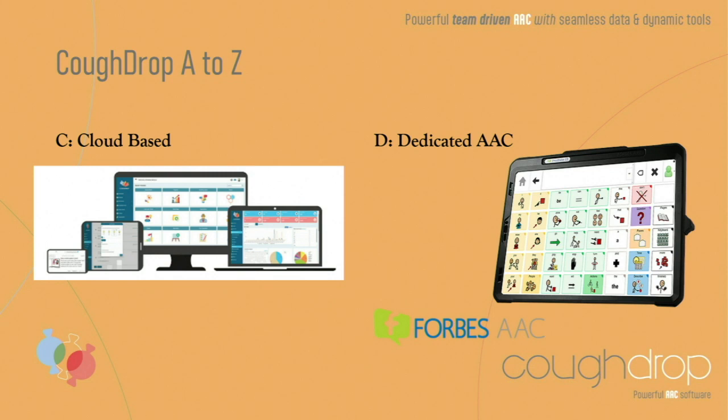You can get the Win Slate with or without eye gaze, and everything available through Forbes can easily run CoughDrop. So know that even though you're using CoughDrop perhaps in a classroom or through your organization, if you have a communicator that has a funding possibility, start exploring a dedicated device. Just know that that's an option, and again, come by our booth and you can see that in action.